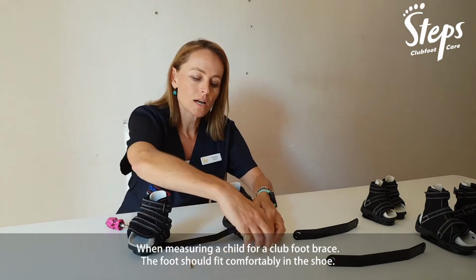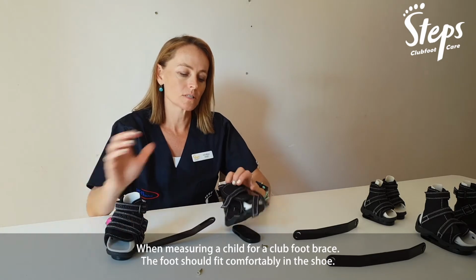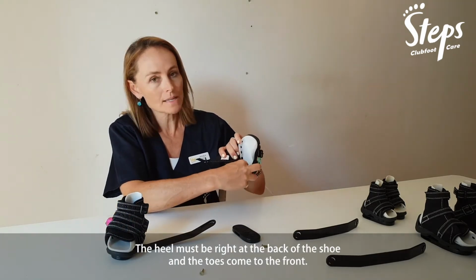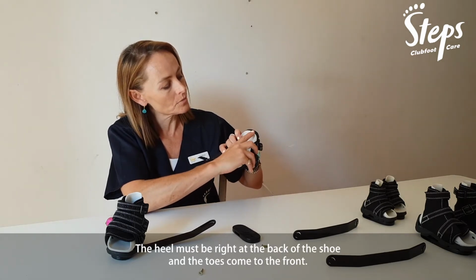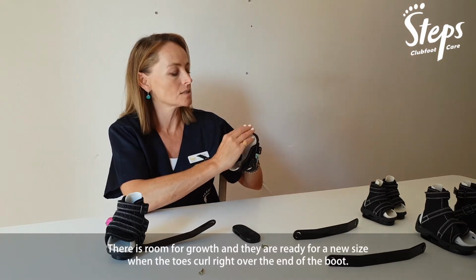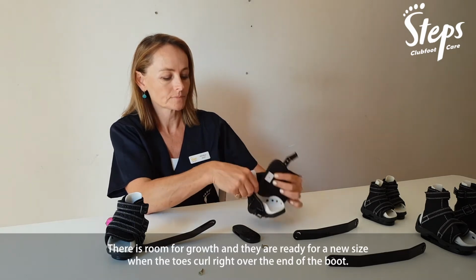When measuring a child for a clubfoot brace, the foot should sit comfortably in the shoe. The heel must be right at the back of the foot of the brace, and the toes come to the front. There is room for growth, and they're ready for a new size when the toes start to curl right over the end of the boot.